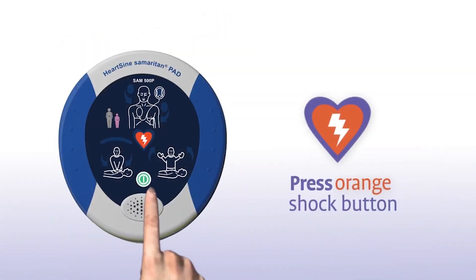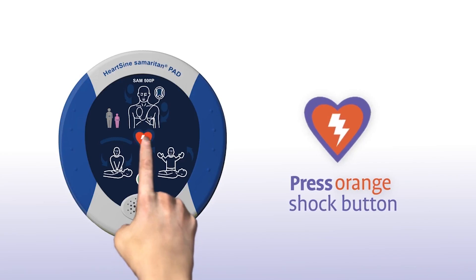Shock advised. Stand clear of the patient and press the orange shock button now. Shock delivered.